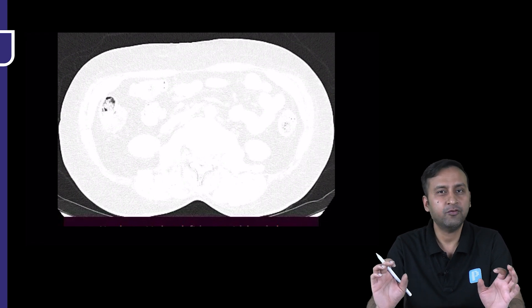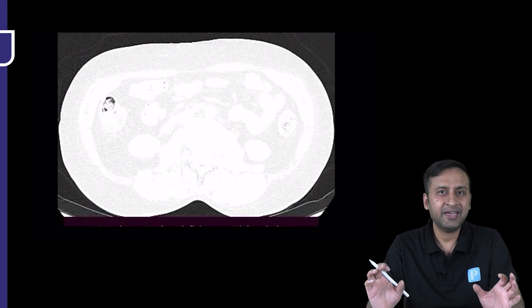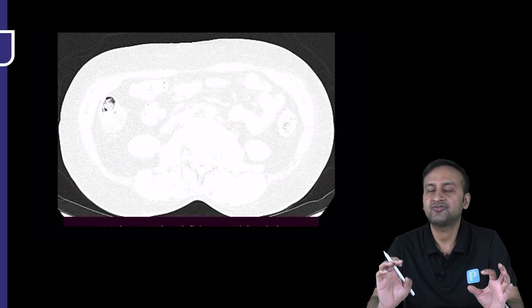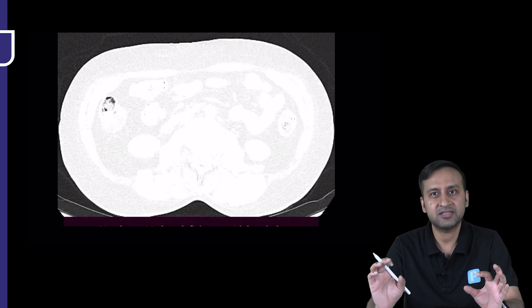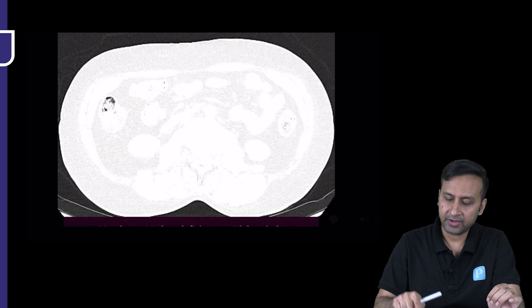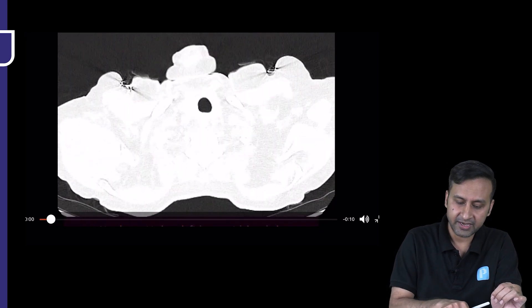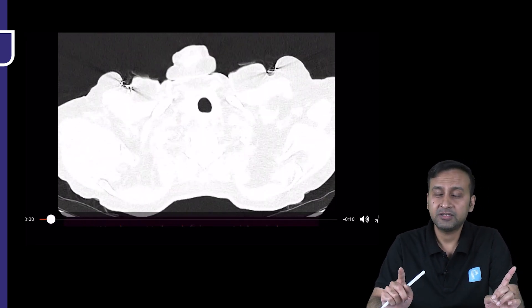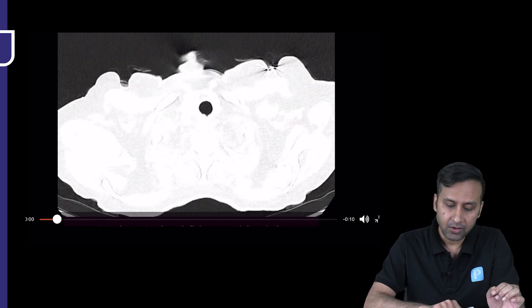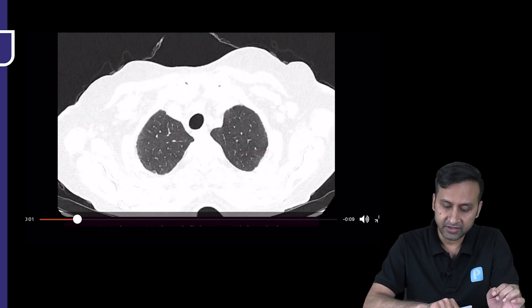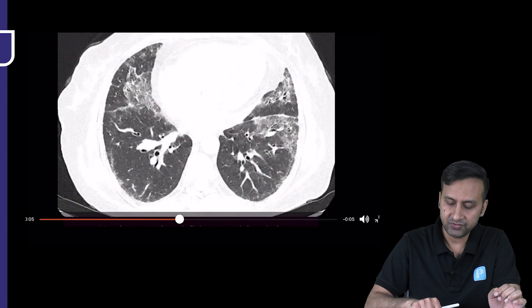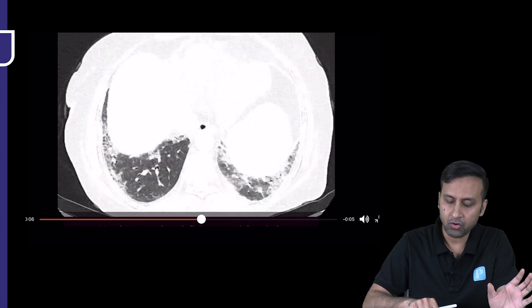If you can answer these three questions in a schematic manner, almost half of your diagnosis is made. Nobody expects you to give a histopathological diagnosis, but if you can answer these three points as a resident or practicing radiologist, that is more than enough. So again, looking at this image: first, are we dealing with an ILD? Yes, it's a diffuse lung disease because we can see a pattern extending throughout the lung fields in a bilateral symmetrical manner.